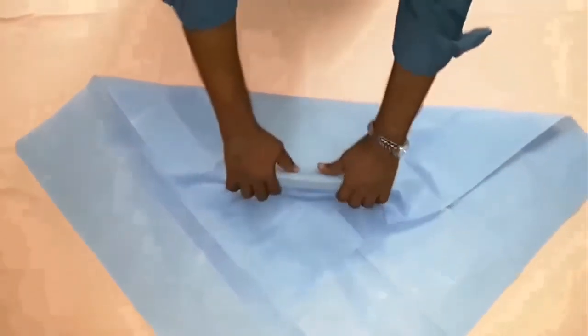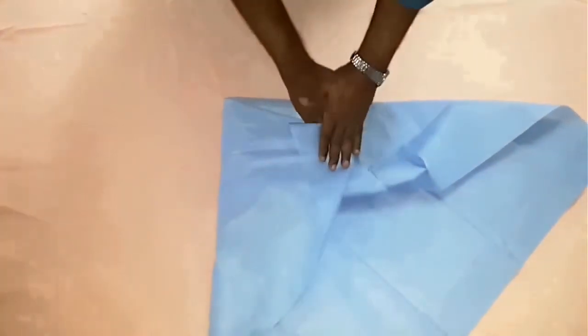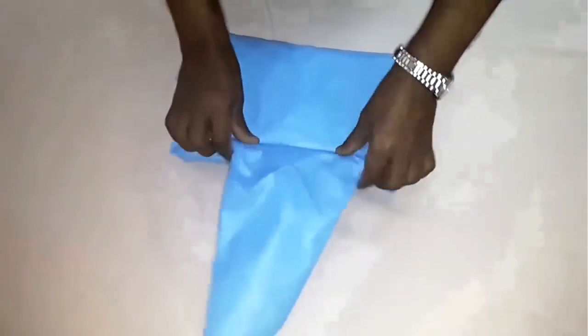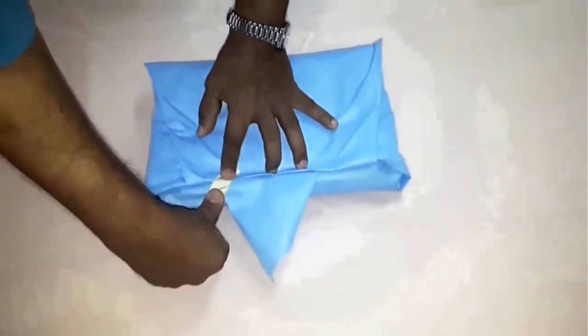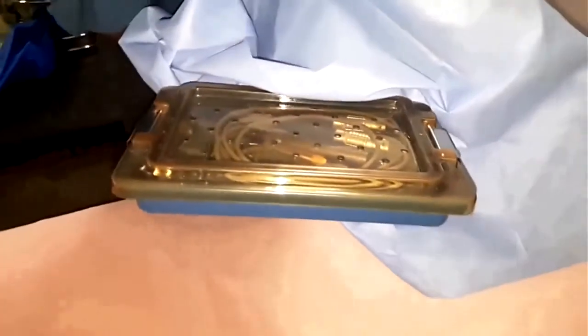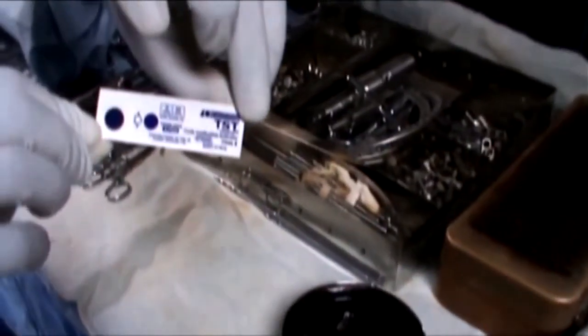This is the envelope method of packing, wherein you introduce an autoclaved or sterilized instrument to a surgical field. So here again, you leave a flap for you to hold when you're going to open it. Always have a leading edge to hold. So whatever instruments you want to introduce into the surgical field once the case has started, please pack them in an envelope method. See how the staff is opening it, so that you're not touching the inner surface at all. And you get the instrument, you can hand over the instrument in a sterile way. Always have an indicator in your packing and check for it once you open the pack before you start the surgery.